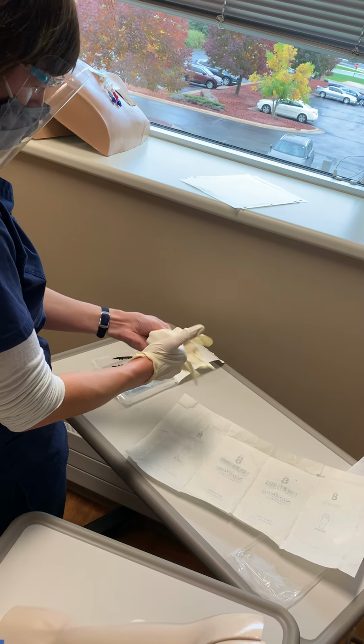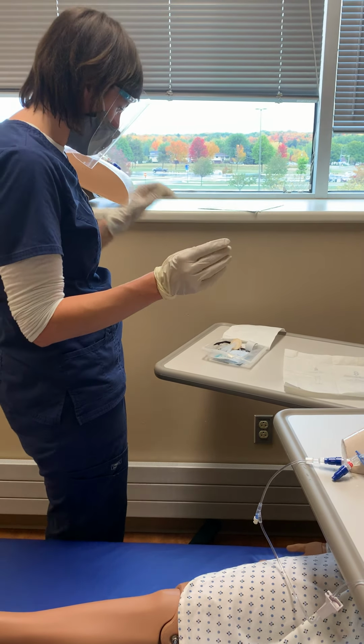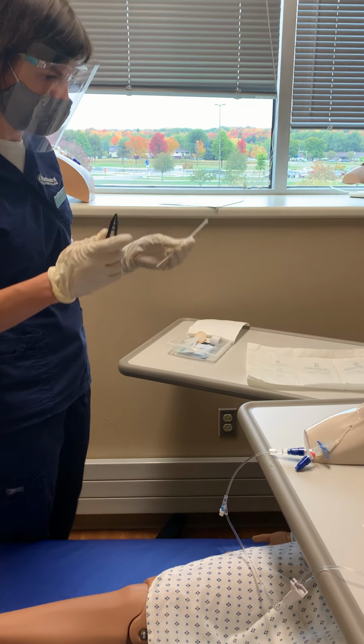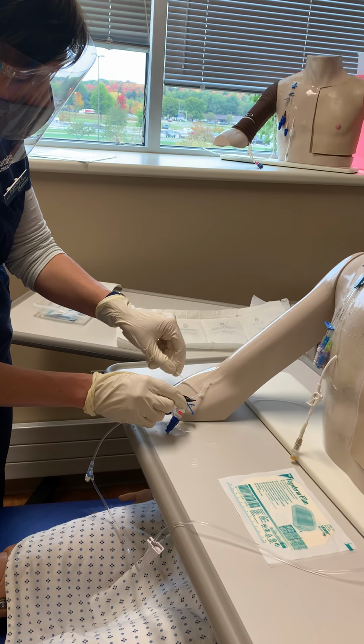I've assessed visually that there's no redness, no swelling, and after cleansing everything, I'm going to touch and check for warmth and tenderness. So I'm going to go ahead and just grab my tweezers first, and my alcohol swab, which is pre-soaked in the alcohol, and I'm just going to hold here, and I would clean up any sort of drainage from the site, like so.